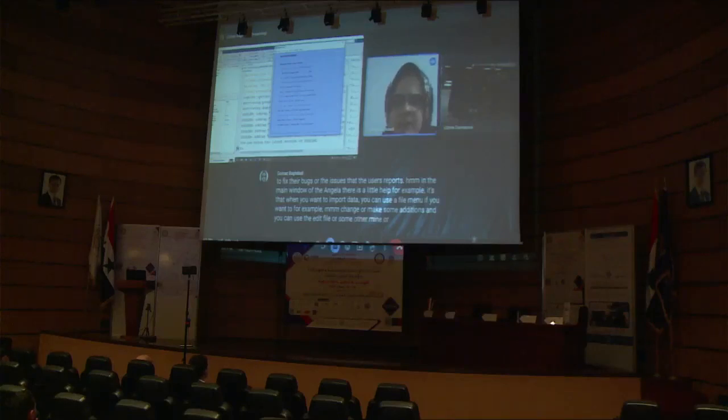But as I mentioned in the offline video, Eeglab has powerful and strong tutorials and documentation on its site. And after this workshop, for advanced use of its tools, you can refer to those documentations and tutorials for further and advanced analysis.